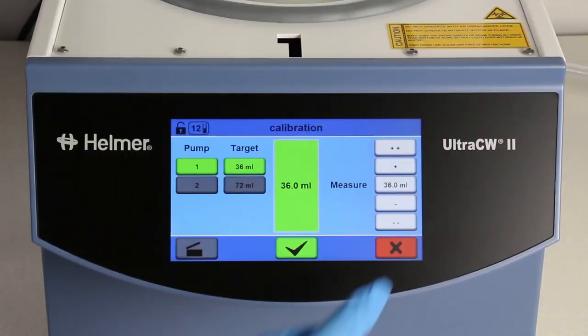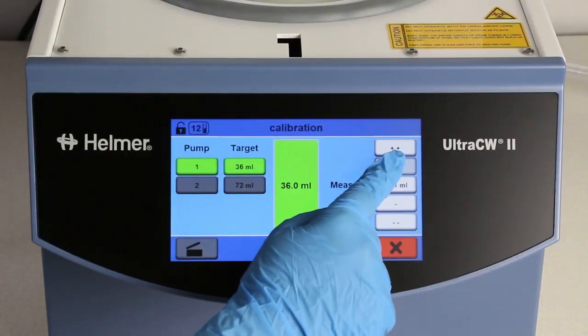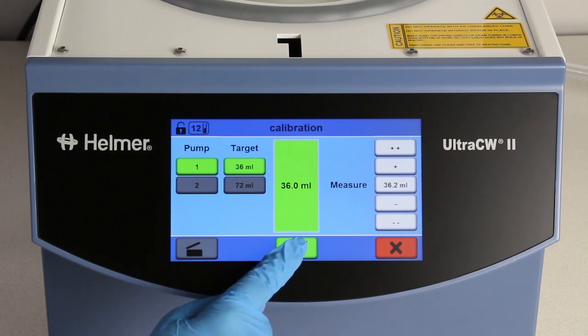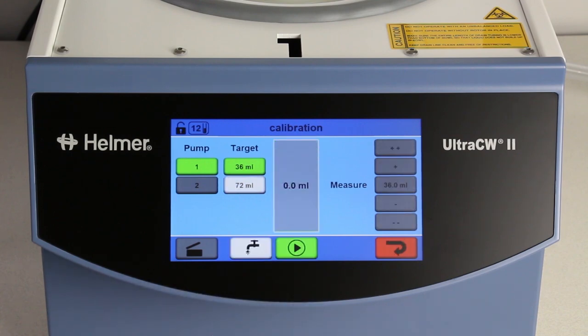If needed, use the plus and minus volume adjustments on the right side of the screen to adjust the number to match the measured volume. Select the green check mark to finish calibration, or use the red arrow to return to the home screen.